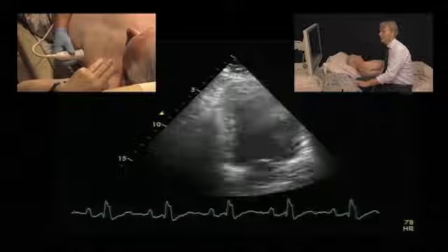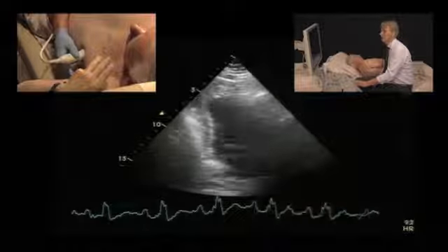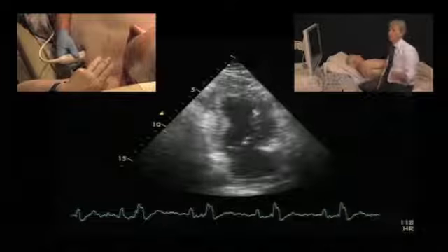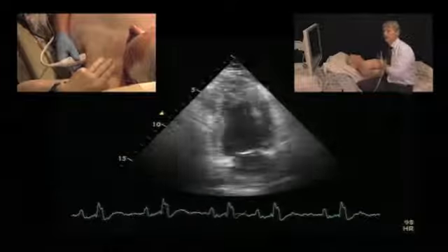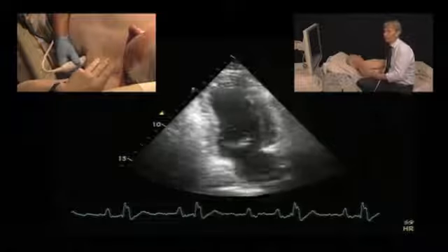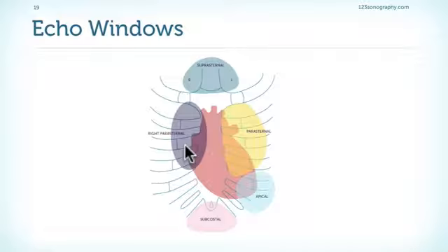inhale. Can you inhale? See, and immediately we get, that is too much, exhale a little. We get better image quality. Sometimes he should not excessively inhale, as in this case, but if he inhales moderately, you can see the anterior and the posterior wall much, much better.